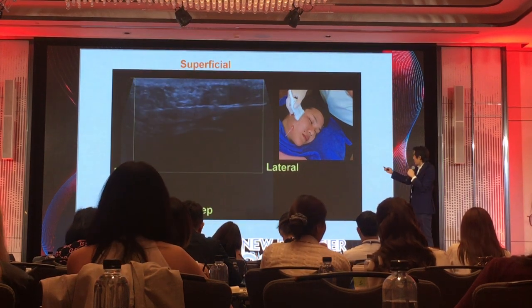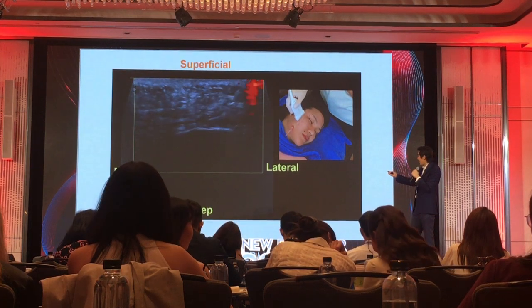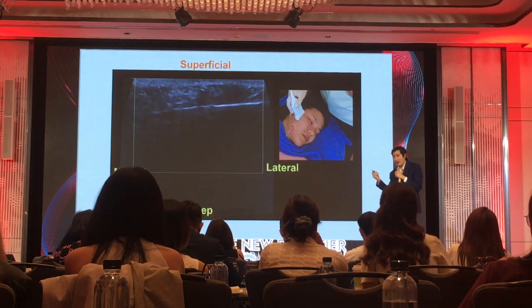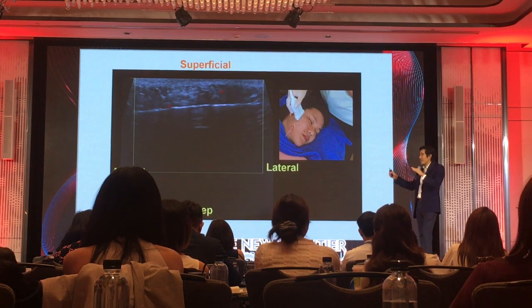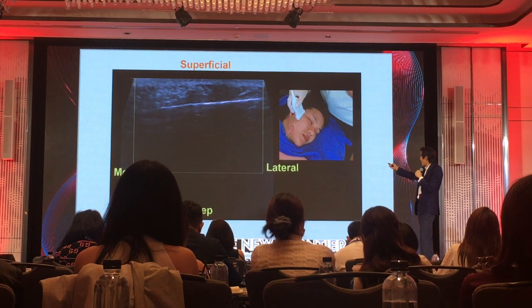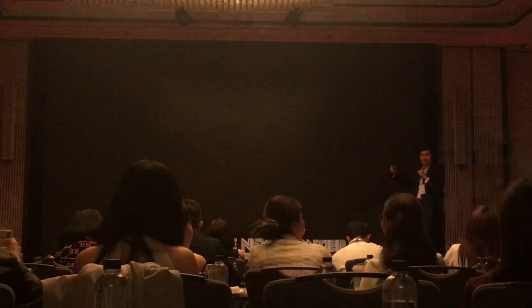because the structures I should be aware of between the tragus and the oral commissure are three vital structures: the transverse facial artery, the parotid duct, and the facial nerve. So you shouldn't go under the SMAS in this area, in this line. And on the zygomatic bone, there are other nerves that I mentioned already in the class.